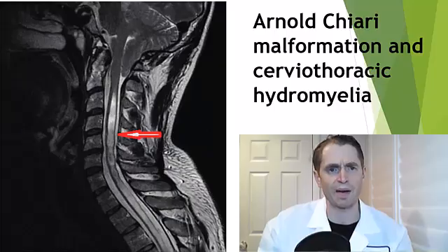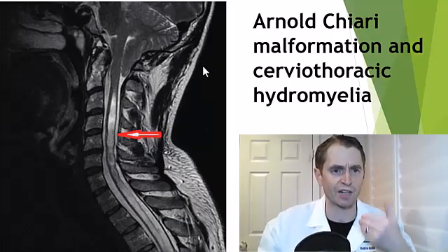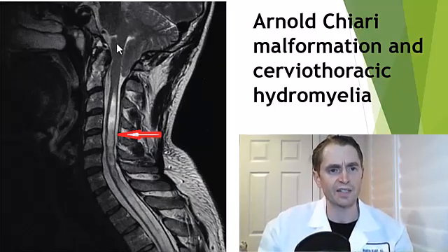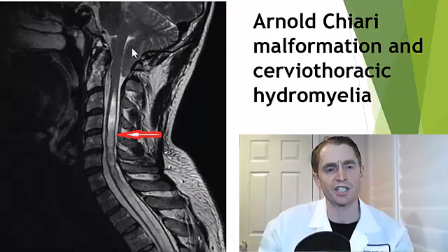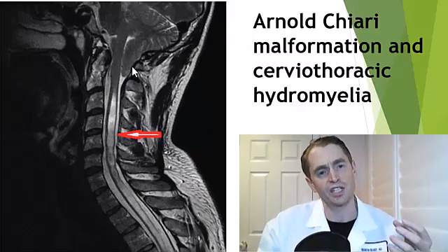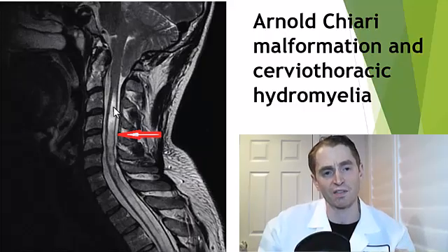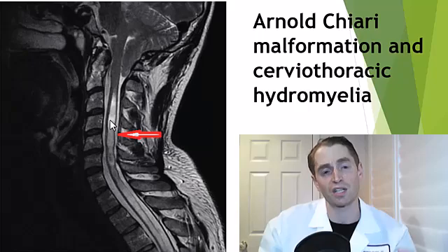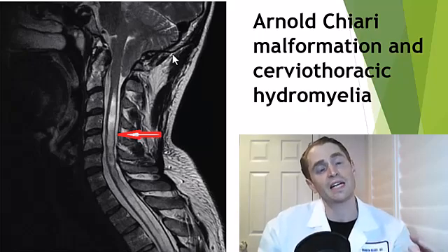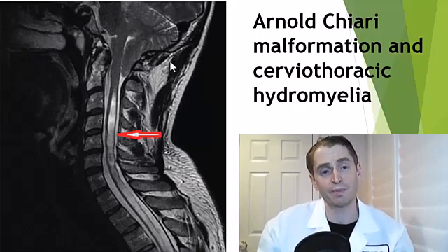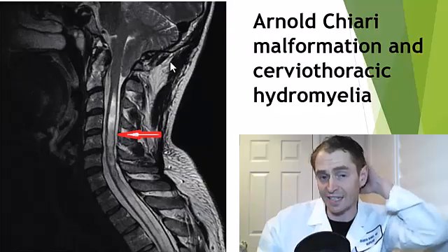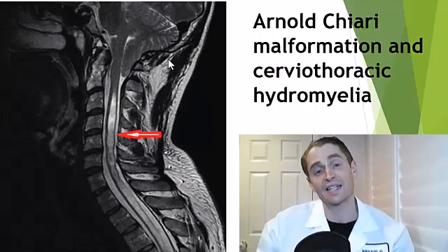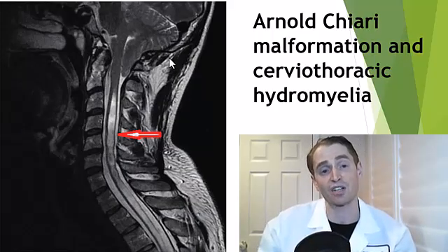This is Arnold Chiari malformation. You're looking at sagittal images. This is the spinal cord, and here's the cerebellum herniating through the foramen magnum. This disrupts flow of cerebrospinal fluid, causing the central canal to enlarge and push on surrounding structures. This image would often be associated with symptoms like headaches in the back of the head, dizziness, and loss of pain and temperature sensation in the neck, arms, and torso.